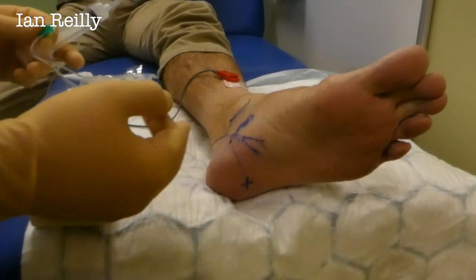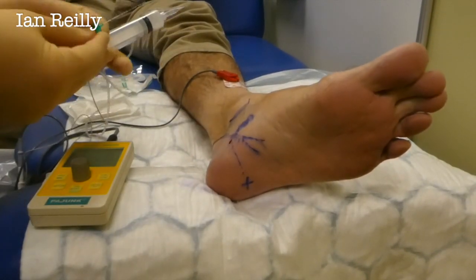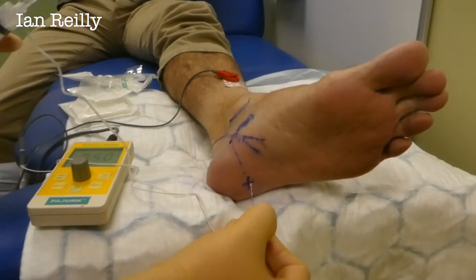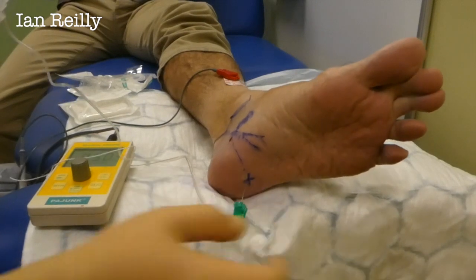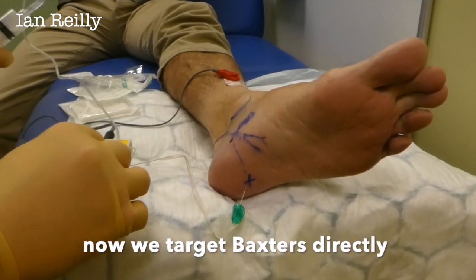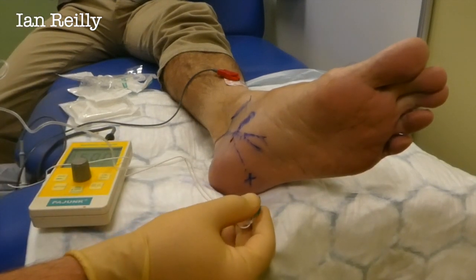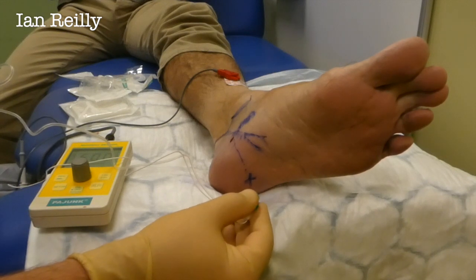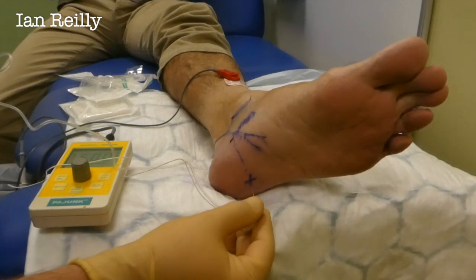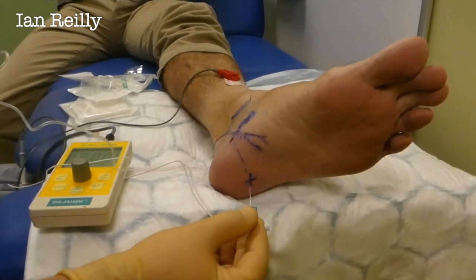Now we'll go into where the scarring is. You're not going to get the same sort of twitching — you may get it a little bit — but I just want to be near it to break up some of the scar tissue on this bottom bit. I'm going to come right to the bottom — a little bit scratchier now. Mainly I want you to tell me if you're getting that nerve discomfort. We're getting some toe twitching again, but you're not really feeling much — that's fine. The local anaesthetic has settled down some of the feeling.